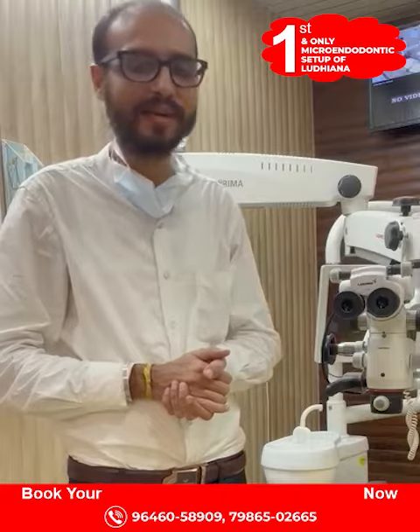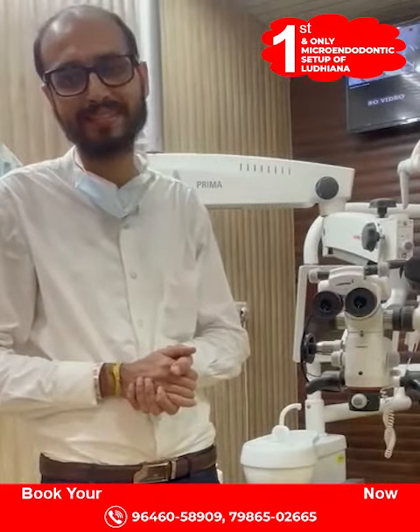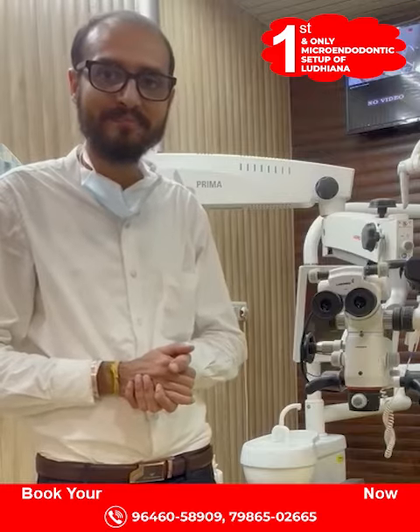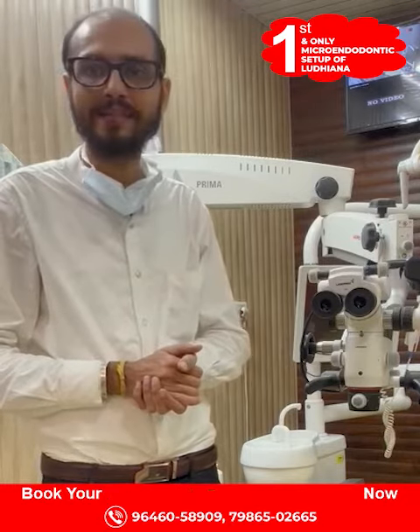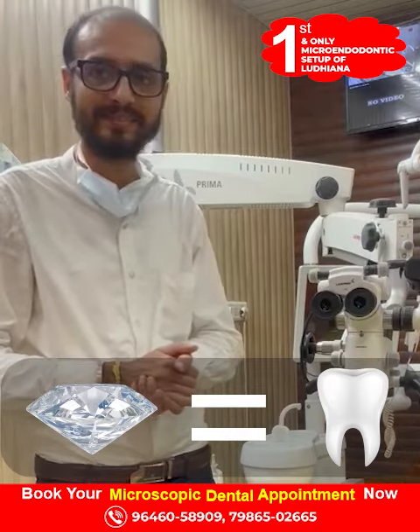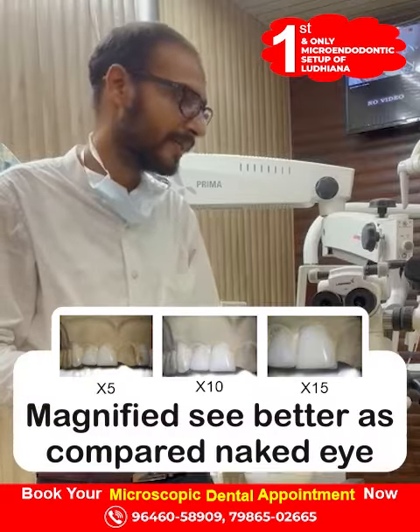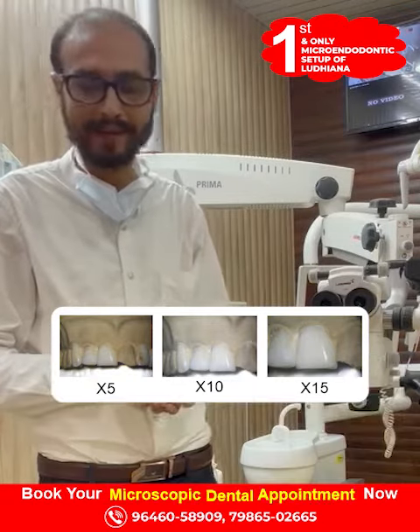I have illustrated with a very simple example, that is jewelry. I don't think there can be a better example for this, especially for the females. If you can invest so much in diamonds and jewelry, why not in your teeth? They are no less than diamonds. We can treat much better if we can see magnified in this microscope as compared to the naked eye.